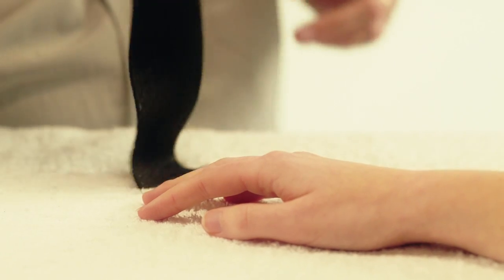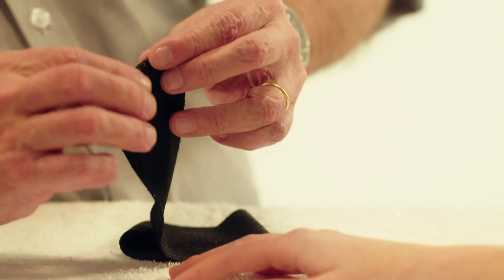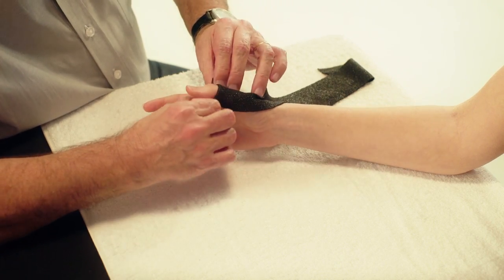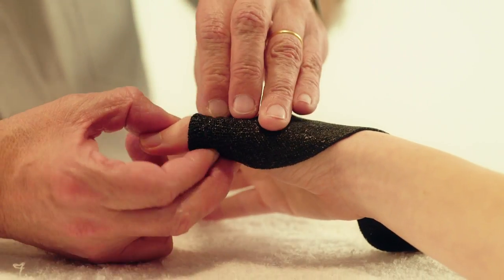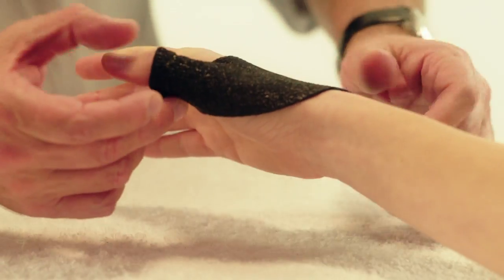Fold over the edge slightly on one side. Place the Orphicast on the dorsal side of the thumb below the IP joint. Overlap both edges just under the IP joint of the thumb on the volar surface and press together.